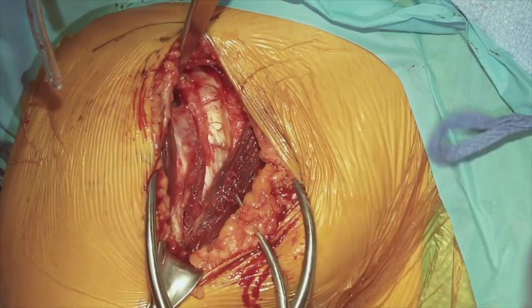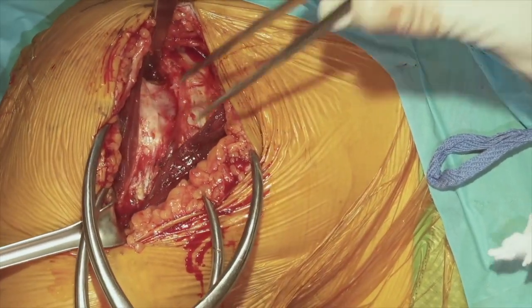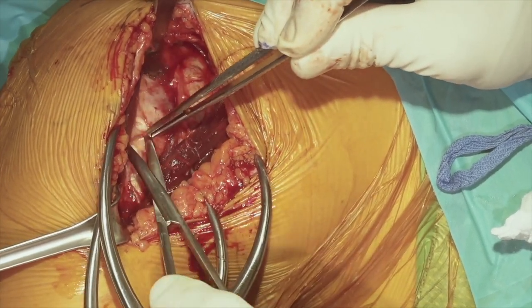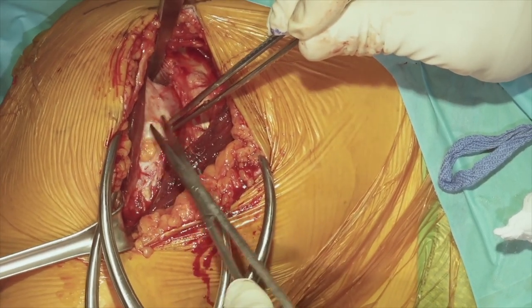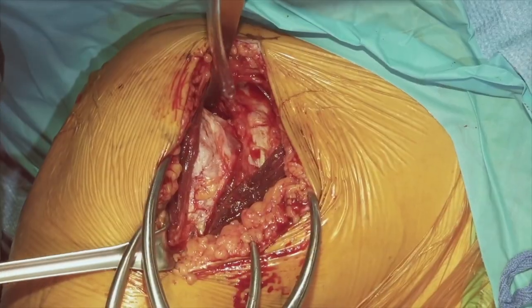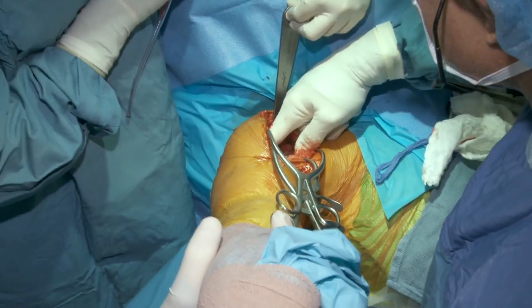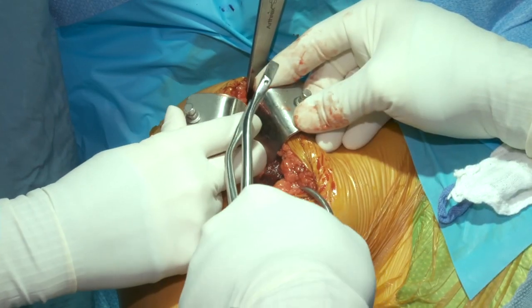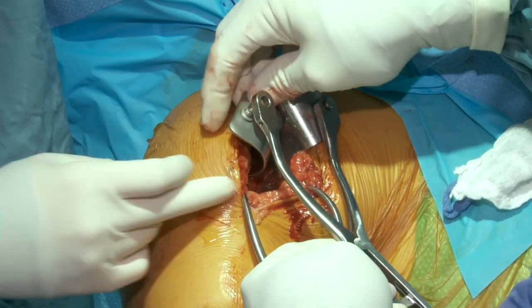Inferiorly is where we'll start to run into our three sisters — the anterior circumflex vessels — and our axillary nerve even deep to that. We just want to make enough exposure to get our retractor in place. For our lateral side, we'll abduct the arm and internally rotate, then free this up by going just underneath the deltoid and proceeding over the top of the rotator cuff, which is going to be deficient — as we already know from our preoperative testing. We'll try a medium and a small retractor. The handle is put in position to hold the blades so they don't slide out easily.